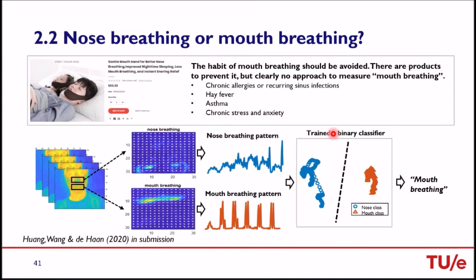But by using the thermal camera based approach, we can easily differentiate nose breathing and mouth breathing. We also want to stress that this is the first kind of this measurement. Not even a contact sensor can measure nose breathing or mouth breathing. Here we are not interested in the respiratory signal. We are more interested in which ROI has been used to breathe.